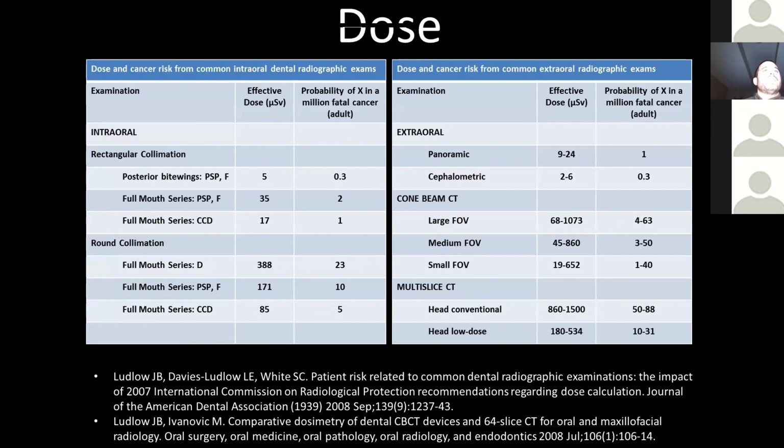The cone beam CT is, unless you have a specific reason to be looking for a pathology, for example, typically a lot more dose than we may need for caries, for example, and even then, caries is hard to find. Small caries is hard to find on cone beam CT.